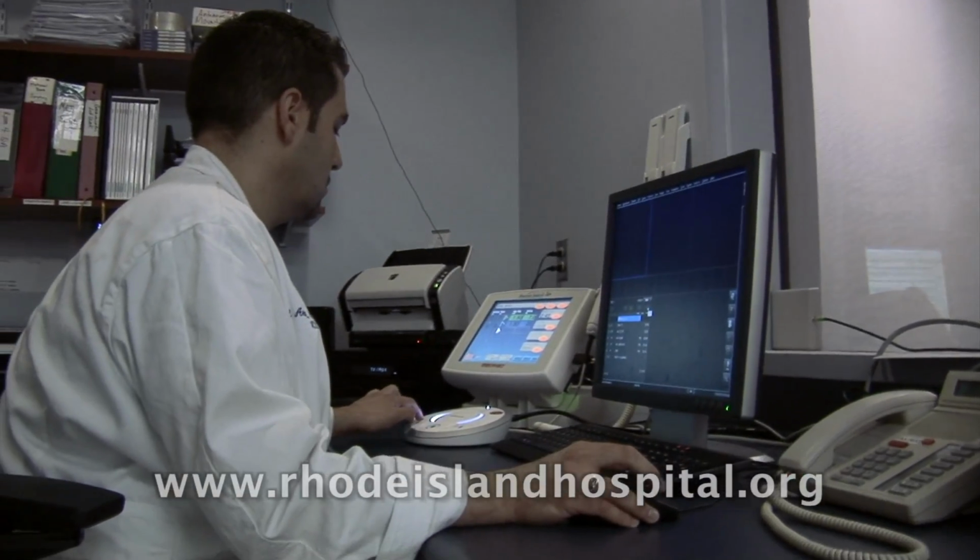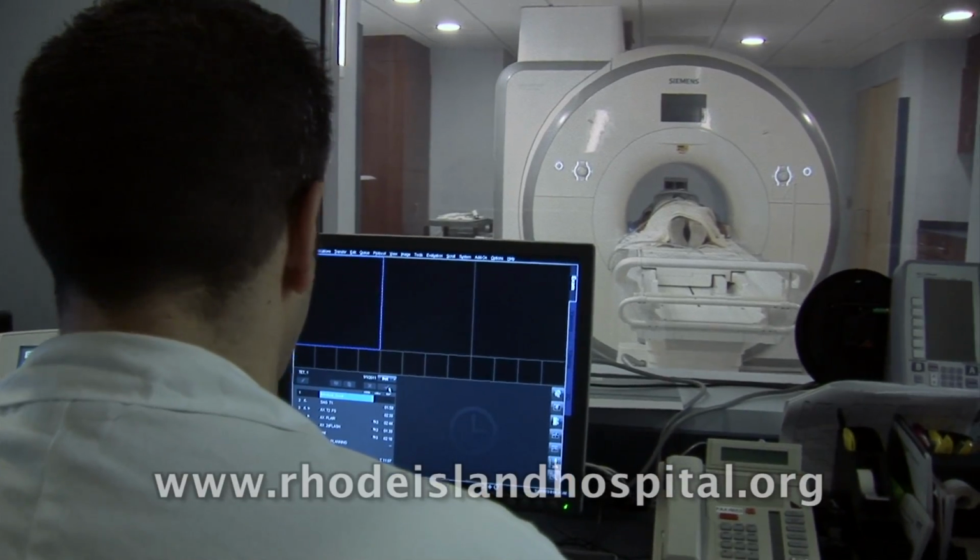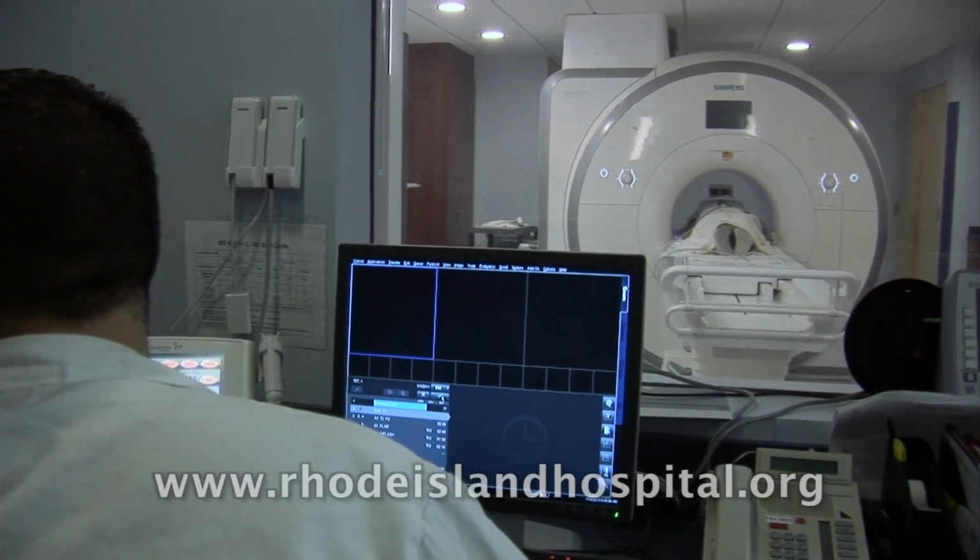The MRI is important enough in medicine that you cannot continue to take care of patients acutely without access to the MRI. We're able to determine the definitive management plan for our patients. If they have a compressive lesion and they need the operating room, well, they don't need to go to an inpatient bed and wait for that test later in the day, only to learn that they needed the operating room.